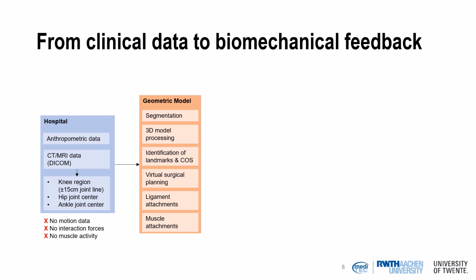But we think that this data is already sufficient to create a so-called, what we would like to call, geometric model. So we can use the medical image data to do a segmentation. And from this segmentation or segmentation mask, we can create a 3D reconstruction. This can be a polygonal mesh if we use, for example, marching cubes, which we can then further process or apply already sophisticated algorithms, for example, for osteophyte removal.